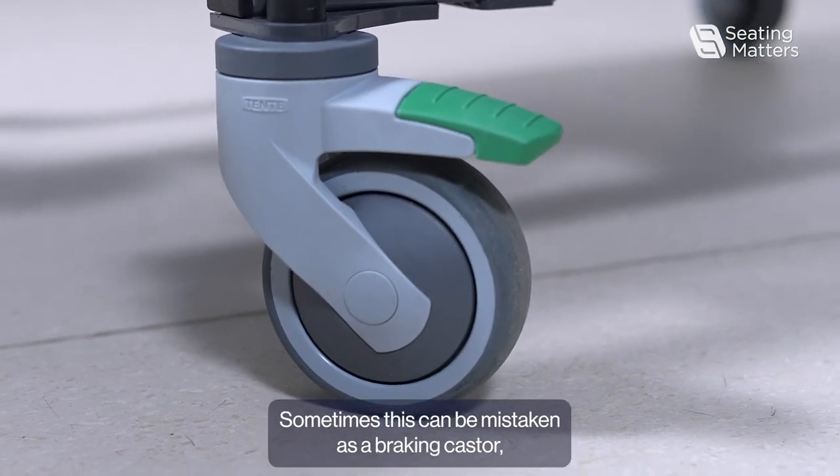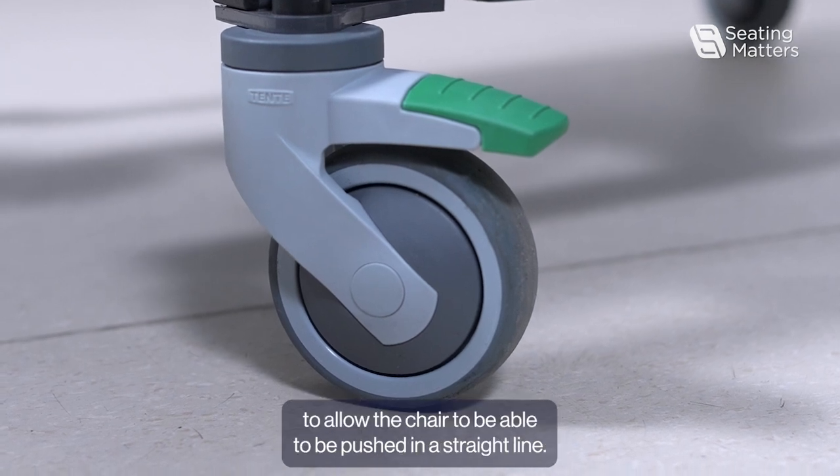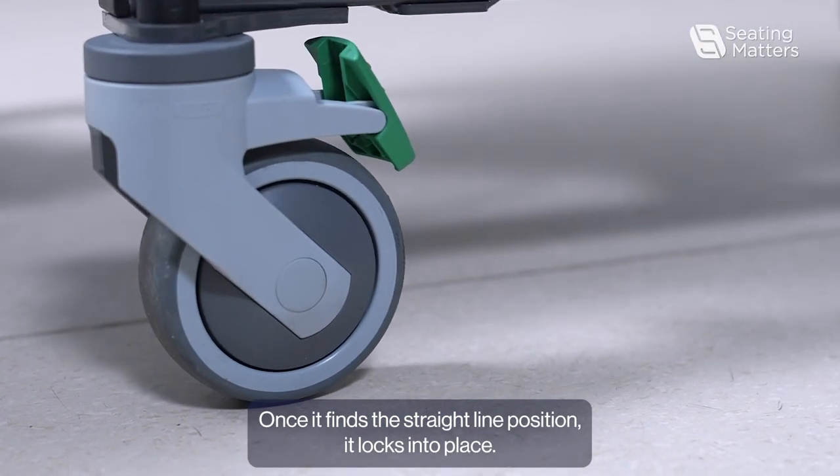Sometimes this can be mistaken as a braking caster, but it is only really used to allow the chair to be pushed in a straight line. Once it finds the straight-line position, it locks into place.